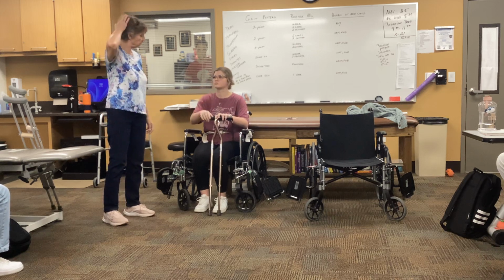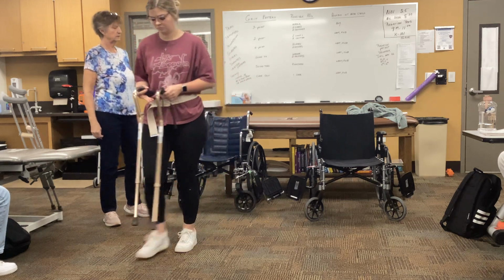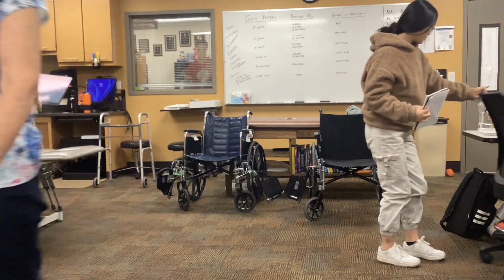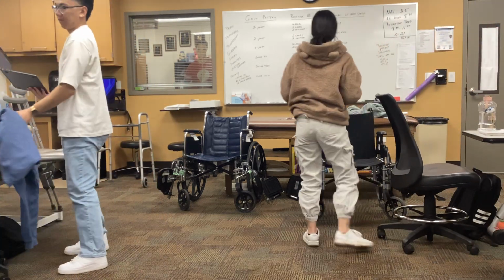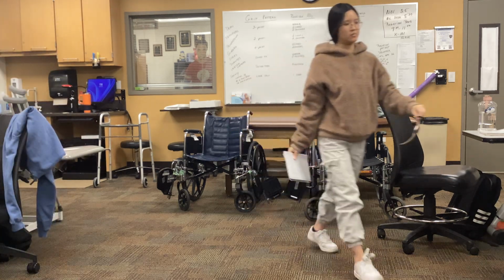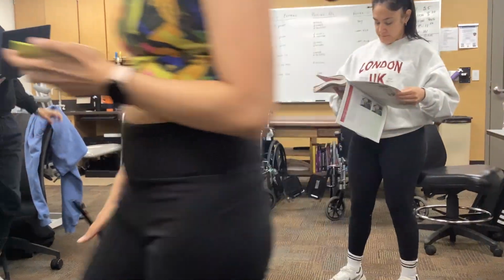Okay, let's just go ahead and walk down to the stairs. Let's take a look at how we're going to do the stairs. So, with a 2-point gait, we have a couple of options.